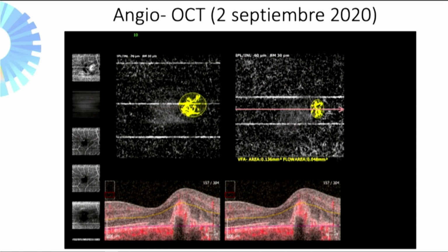And since I'm a curious person, since I had the equipment available, I measured visual acuity, another OCT, and another angio-OCT. And soon after the anti-angiogenic that we injected her, that was aflibercept, in a week, there was a reduction of the neovascular membrane that could be measured, and there was a reduction in the flow, and her sight was 20/50.